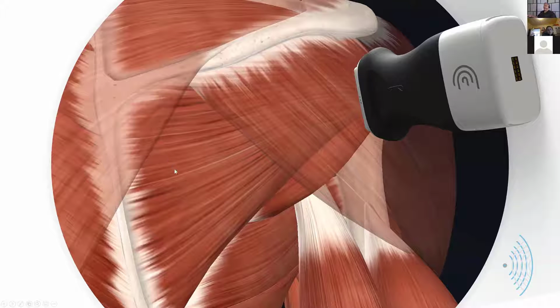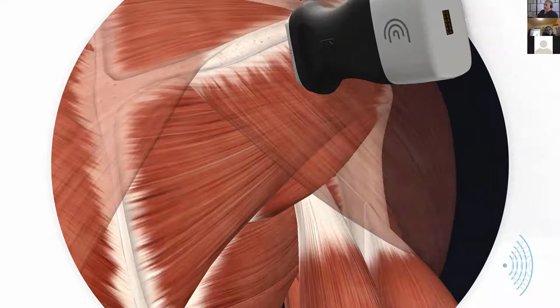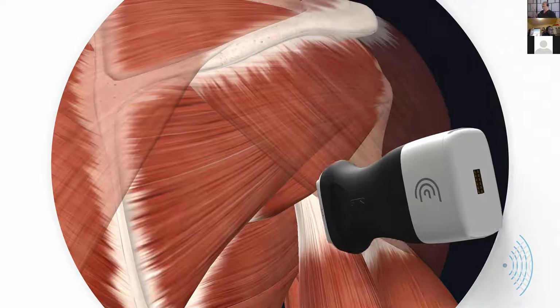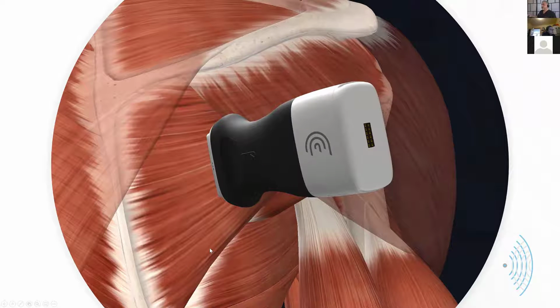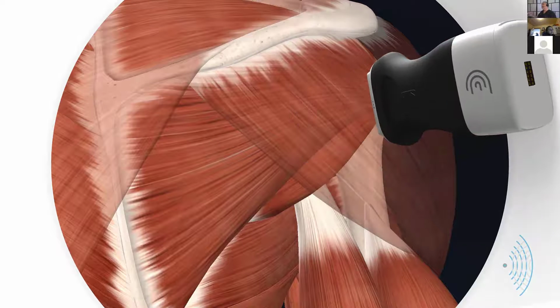There we go. So what I want to have you now realize is that we already pointed out that we're looking at the teres minor here, the infraspinatus here, and the supraspinatus up here. But in this drawing, I've actually called out the deltoid over the infraspinatus and the upper trapezius over the supraspinatus. And we're going to be scanning in what's called a slice scan or a skate scan. We're going to be cutting right through the structures of the rotator cuff like such. And then we're also going to be doing what's called a sweep scan. And in a sweep scan, we're going to be taking a look at the muscles from origin to insertion.